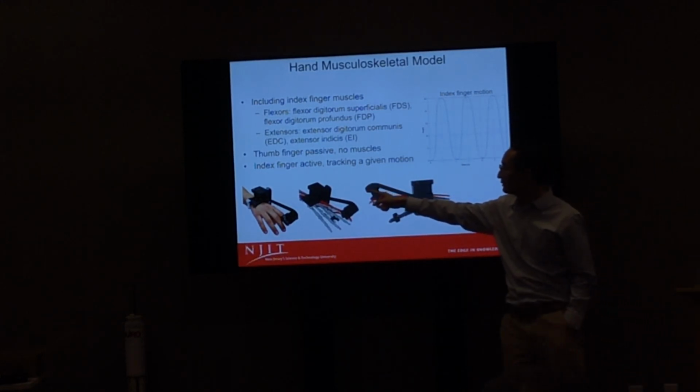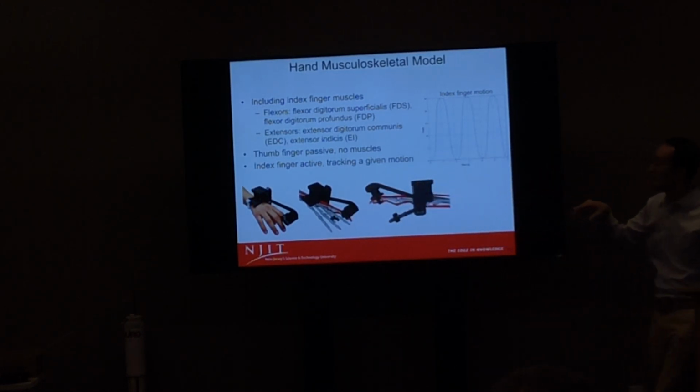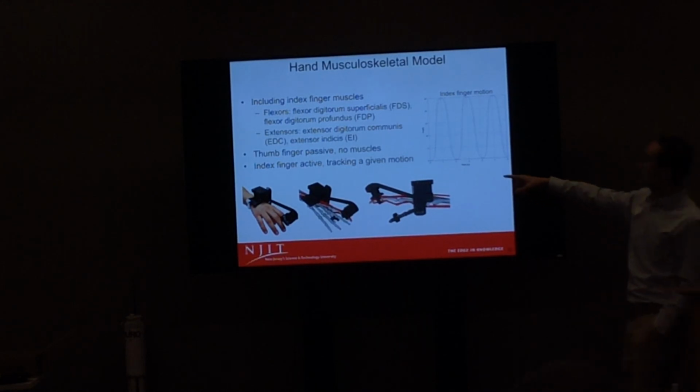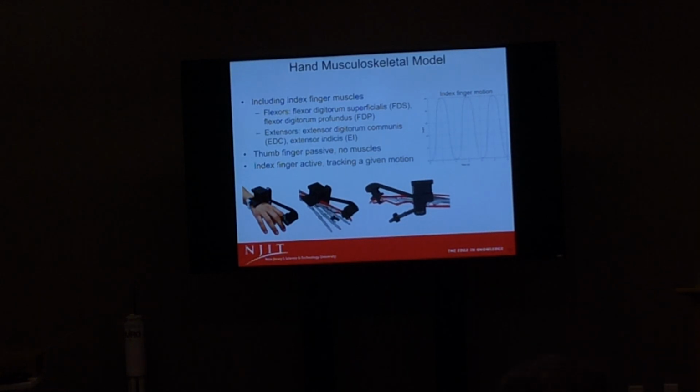We have a real force sensor. Based on this force sensor, we use admittance control, which I will talk about a little bit later. But in this modeling, let's say we want this finger to follow and track a motion, finger closing and opening. We see how we can do that.